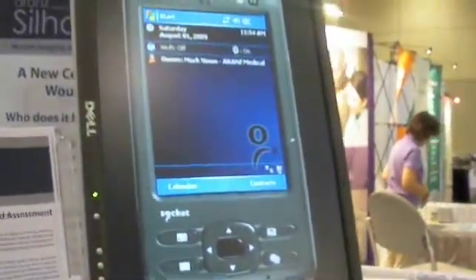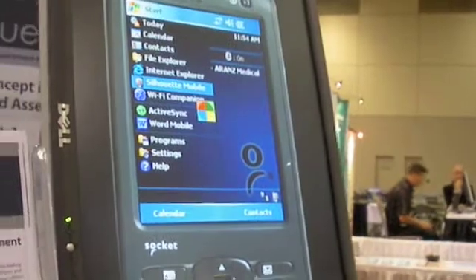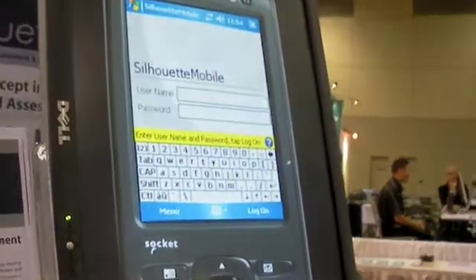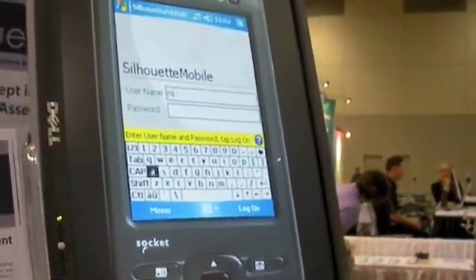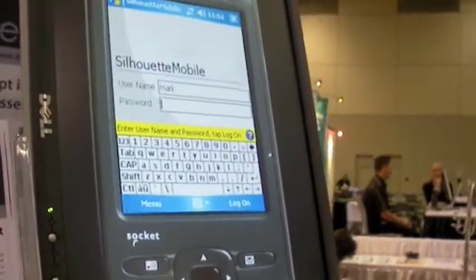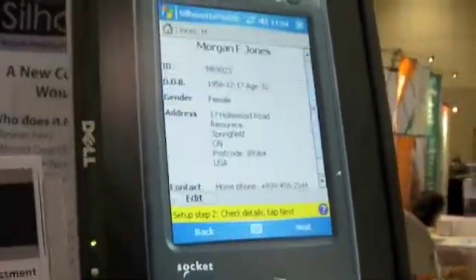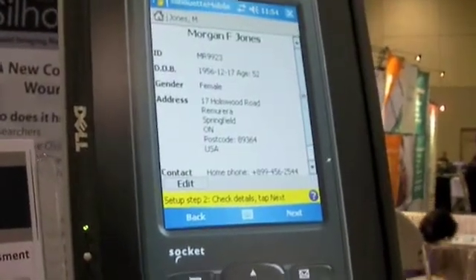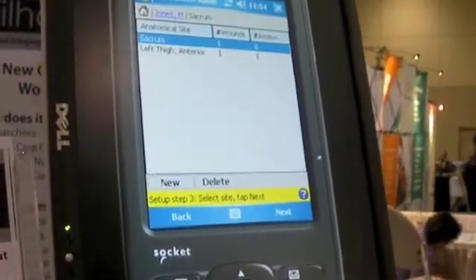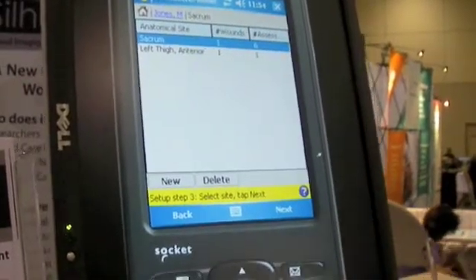I'll first log into the system. Every user is identified with a username and password. The system first displays the users that are present in the database. I'll select one of these patients. We can review the details to make sure they are correct. The patient will have one or more wounds that are currently under investigation.